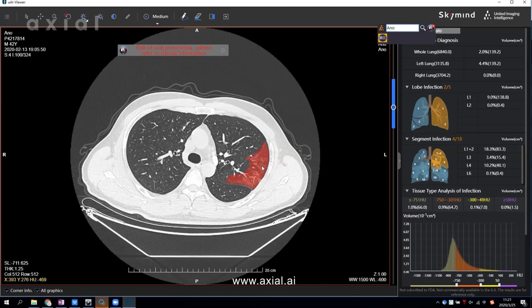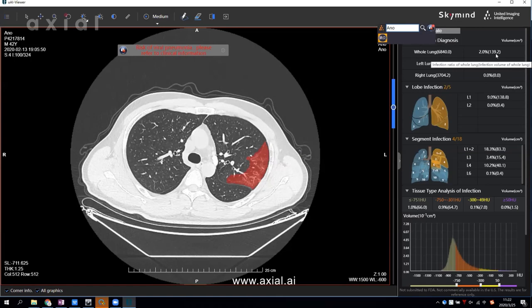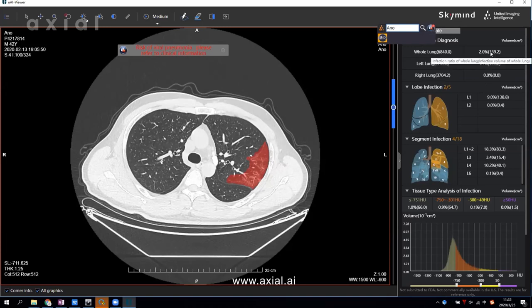Axial AI is not only providing detection, but it gives you a very precise quantitative measurement. In this section, it shows the volume of the infection region in cubic centimeters — for the whole lung, as well as measurements for the right and left lung separately.